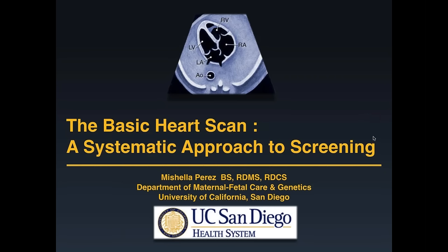Should the LVOT and the right ventricular outflow tract be obtained on all scans? Yes, according to the current AIUM guidelines and also the ISUOG guidelines, the LVOT and the RVOT are part of the basic screening guidelines. They should be included on all scans.